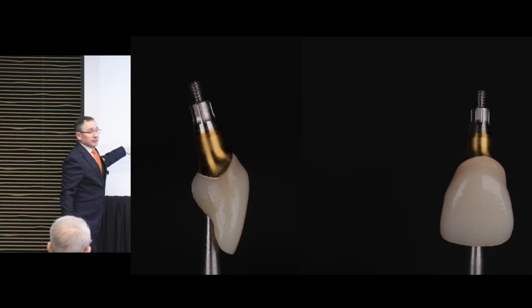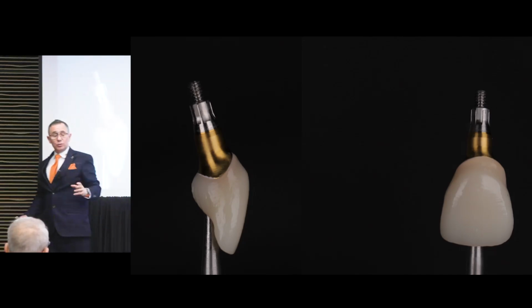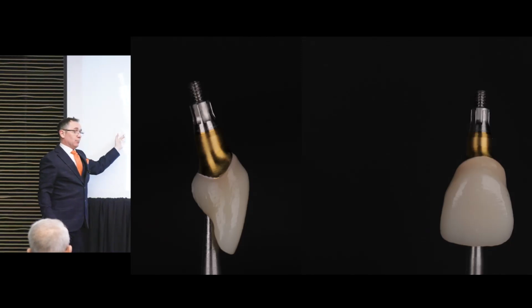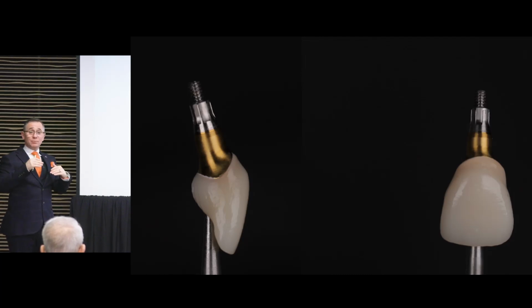And again, very much for your questions, when we look at these, they are only polished there. That is not glaze. We do not use glaze anywhere in the subgingival emergence. A lot of the hybrid bases that I'm looking at there, I kind of cringe now, because in the early days I was too cautious. We were going too deep, so we were still not utilizing the full height.